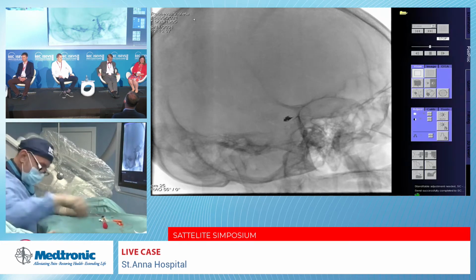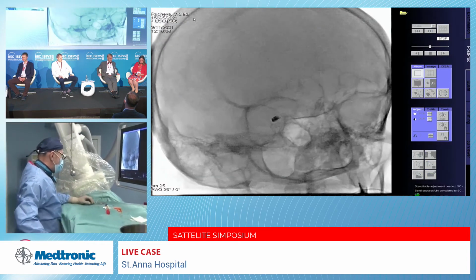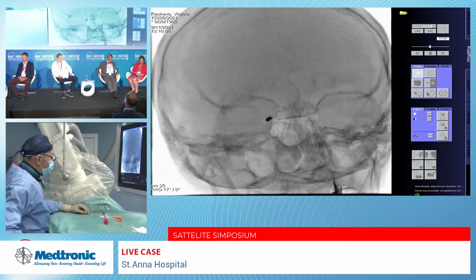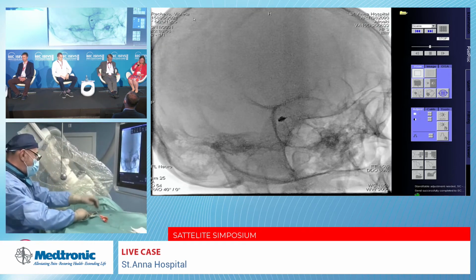Okay. The visibility of the stent is okay. Final control angio.